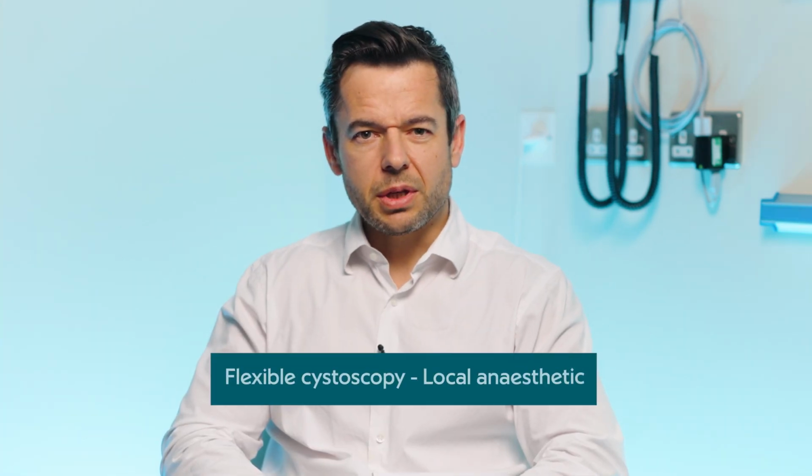We often use it if we're investigating things like blood in the urine or urinary symptoms. Under general anaesthetic, it can also be a very good way of treating problems within the bladder or sampling the tissue in the bladder, taking a biopsy in order to better understand someone's condition. It's very commonly used for treating bladder cancer or for treating bladder stones and other bladder conditions, but is often used to rule out some of those conditions as a check for people who want to make sure their bladder is healthy inside. So flexible cystoscopy under local anaesthetic can be performed in the clinic.